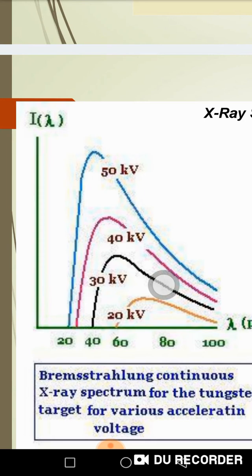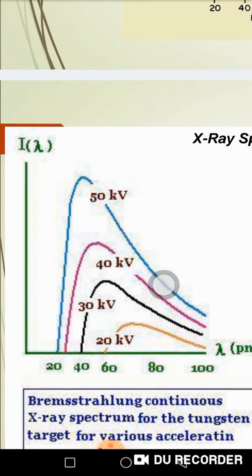This means that not all the X-rays from the tube will carry the same energy. Rather, they will carry a spectrum ranging from low energy to high energy. The high energy value corresponds to the kV that I set. If I set it to 50, the highest photon energy will be 50. If I set it to 120, the highest photon energy will be 120, and so on.